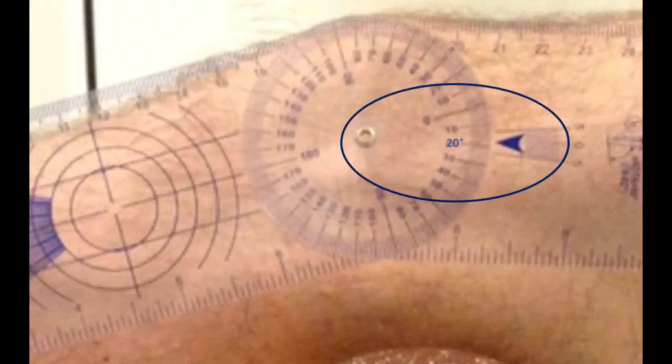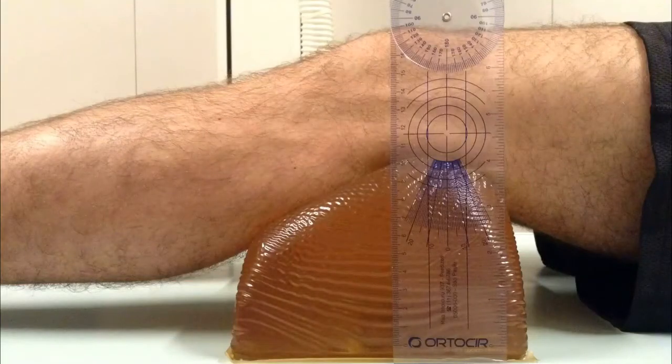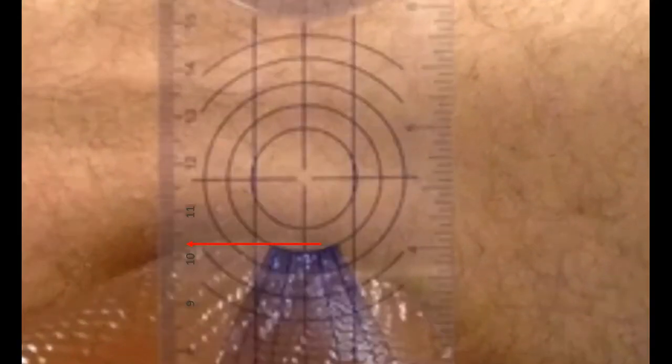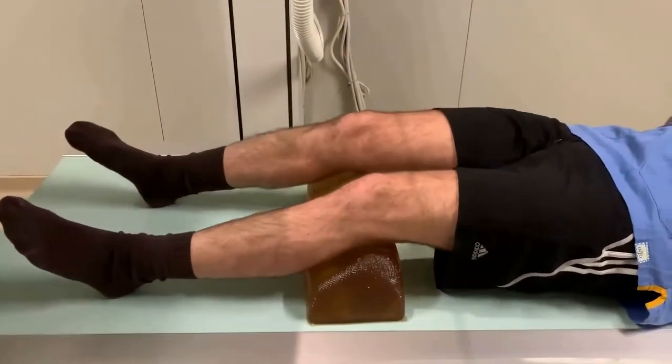To achieve this desired flexion, use a cushion approximately 10 cm posterior to the knee in individuals of medium height. The height of the cushion may vary according to the patient's height. We position the patient at the end of the table in order to facilitate the radiograph with stress on the knee.